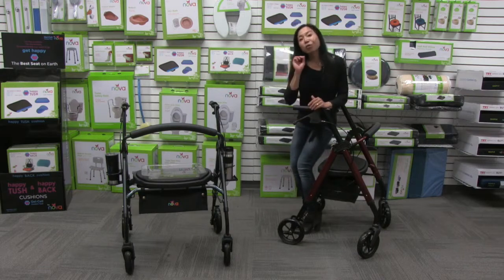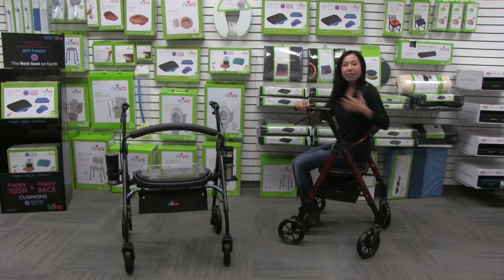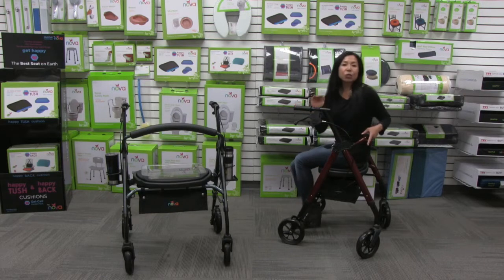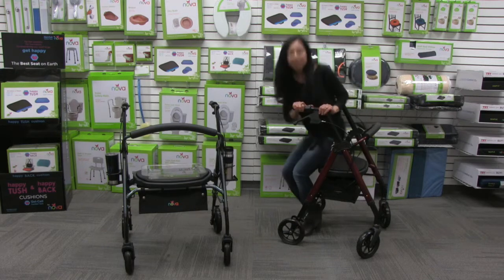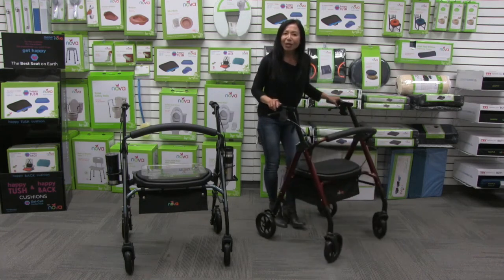Make sure that your brakes are always in a locked position when you are sitting down. Now I can take a comfortable seat and also rest on this padded backrest. Make sure your brakes are always in a locked, parked position the entire time you are seated — it's for stationary sitting only and no scooting. Now I'm going to get myself up, release the brakes, and now I am ready to roll.